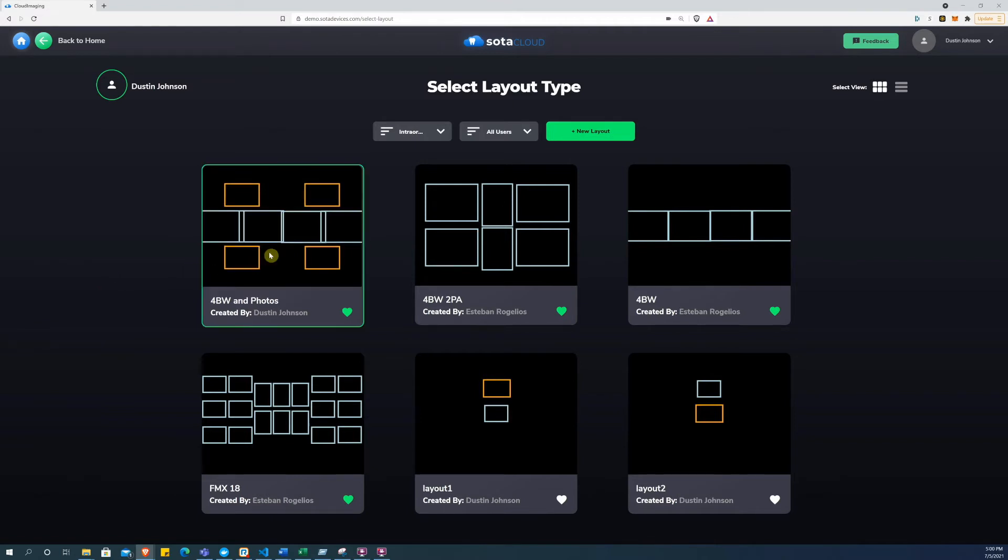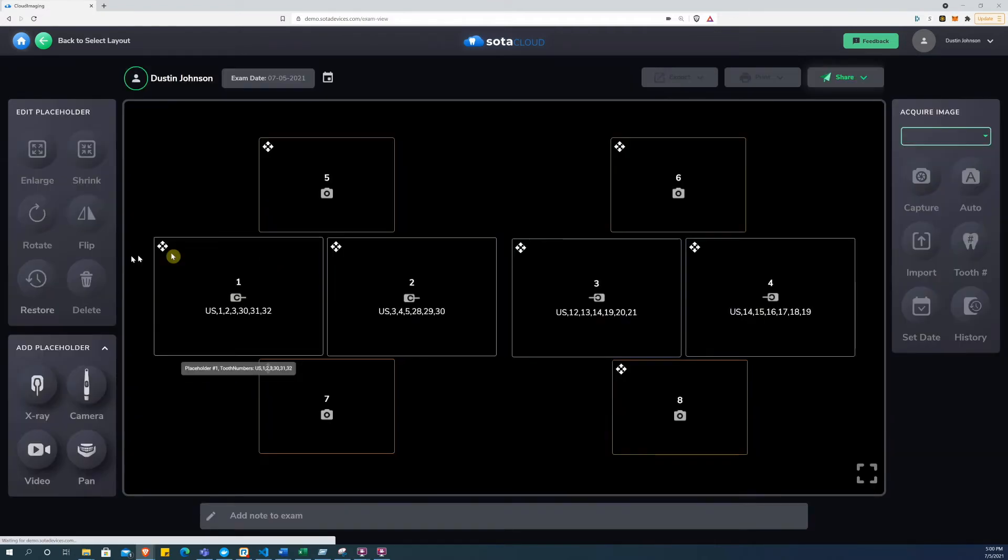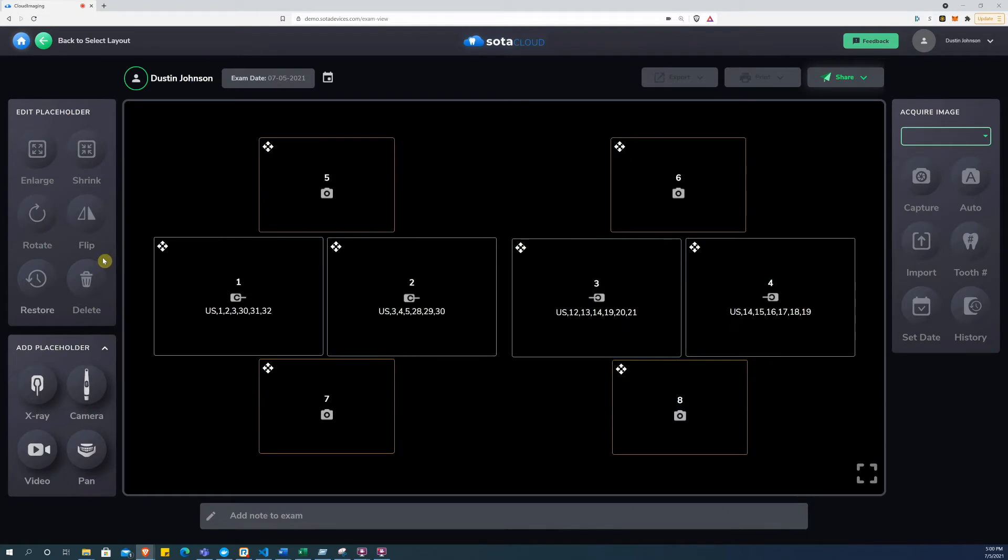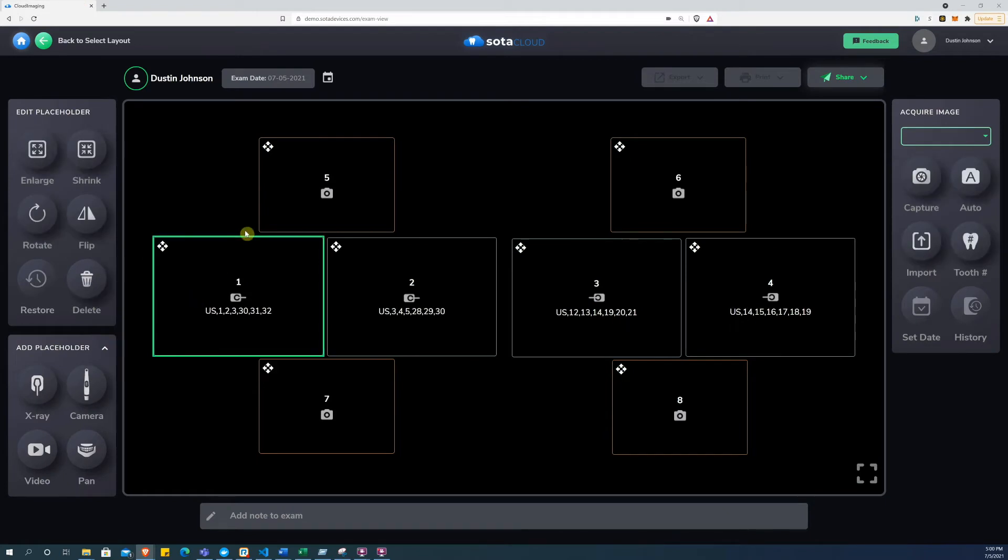In the layout I select here, you can see we will take x-ray images and camera images. All of the buttons in the exam view are clearly labeled and easy to use.